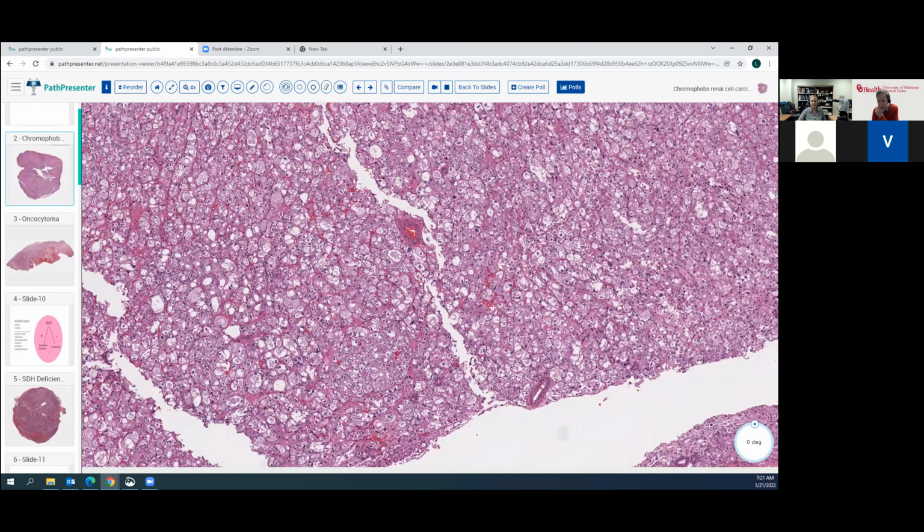Germline can be men or women. On histology, the cells have voluminous eosinophilic cytoplasm with coarse basophilic cytoplasmic granules, as we pointed out in our tumor. Or basophilic stipple, sorry. These are the eosinophilic cytoplasmic granules here. These tumors are positive for cathepsin K with focal CK20 positivity, and this is nice because not many other pink renal cell carcinomas are going to be positive for CK20. These tumors are also going to be negative for CD117 and CK7.